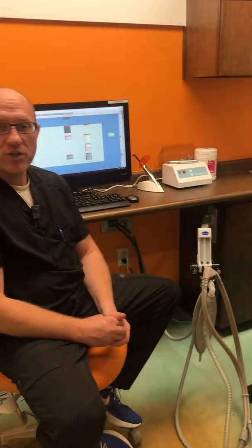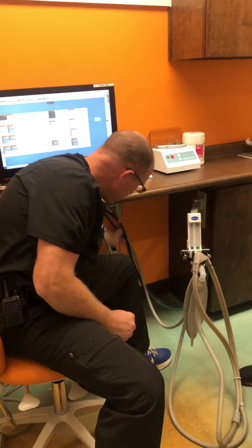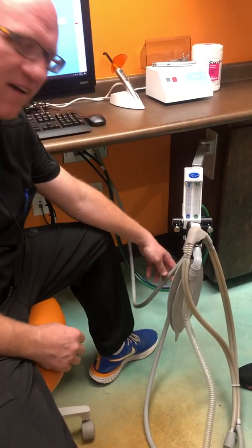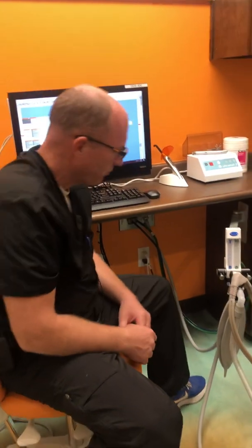First thing I want to mention is there are three hoses that run to this machine. There is the blue hose right here, which has our nitrous. There is the green hose, which has our oxygen. And there's the gray hose, which is our vacuum. All of those run to the machine and all do their individual function.